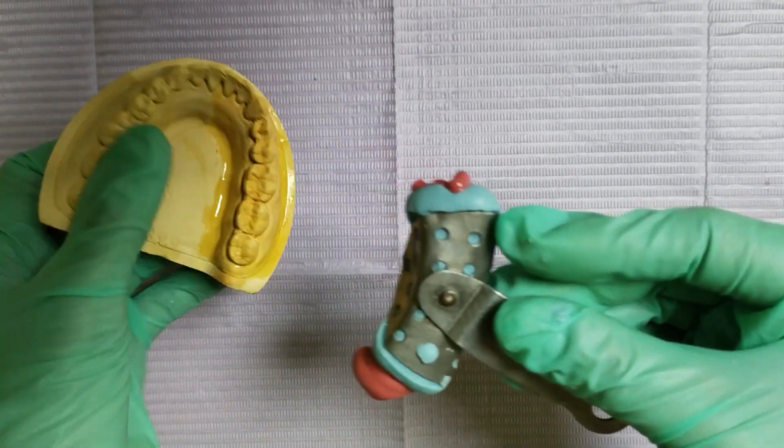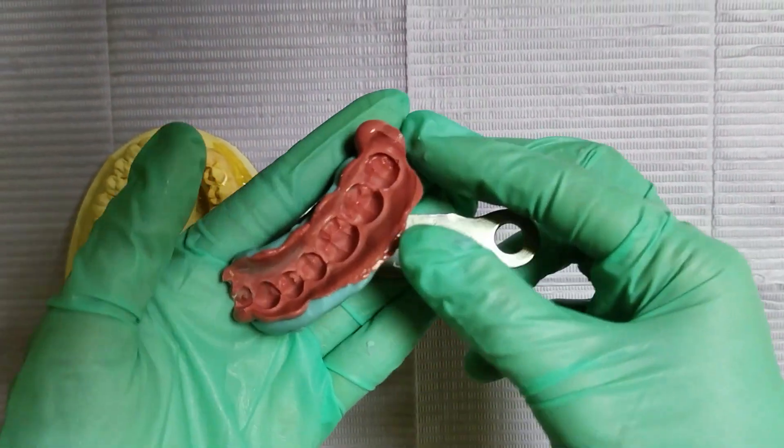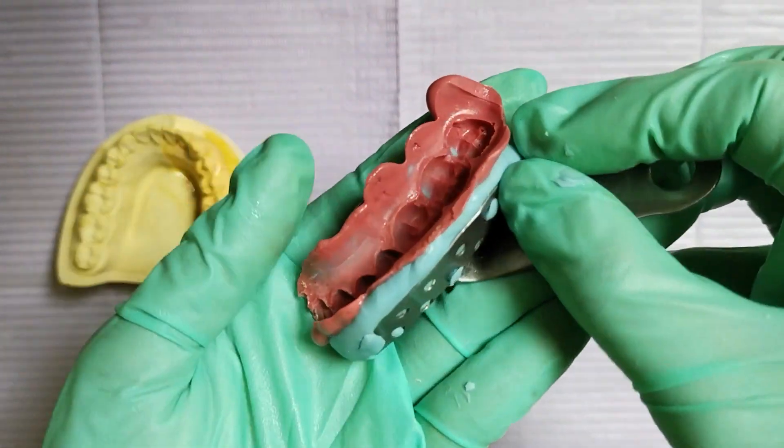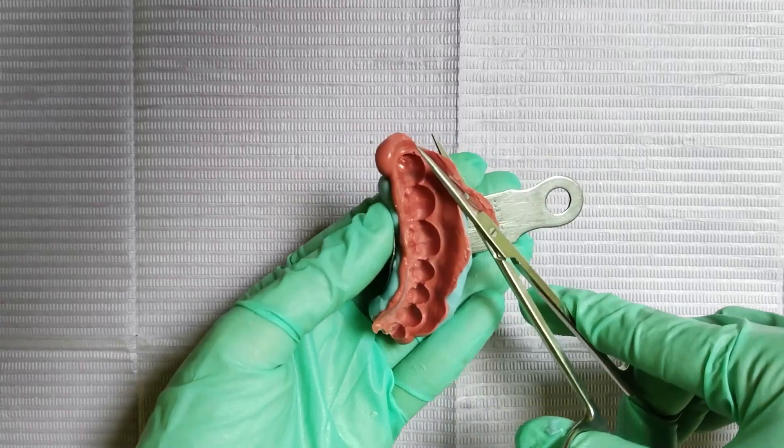Inspect your impression after removing. It should have no holes, no voids, and no bubbles, especially on the area of the teeth and the gingival margins.